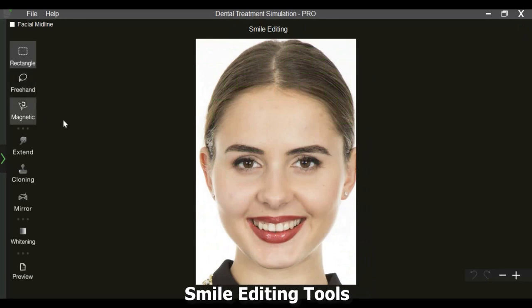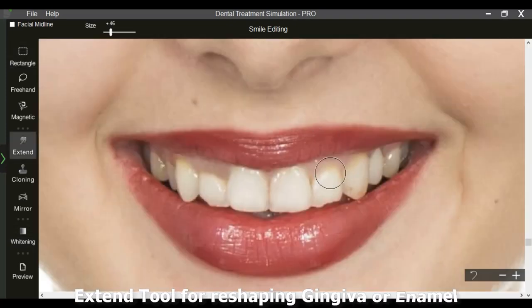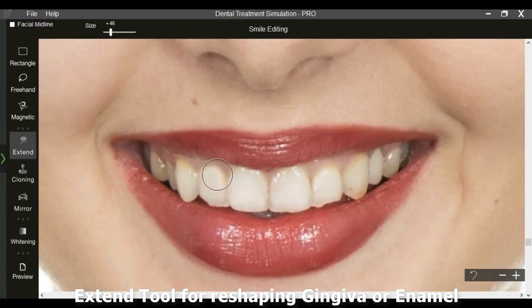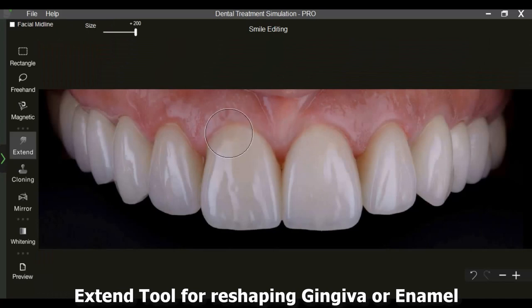Let us see the function of the smile editing screen, which has selection and editing tools along with the whitening tool. The extend tool can be used to reshape or extend the gingiva. With just a few strokes of the extend tool, we can create an instant preview for the patient to easily visualize the planned treatment.